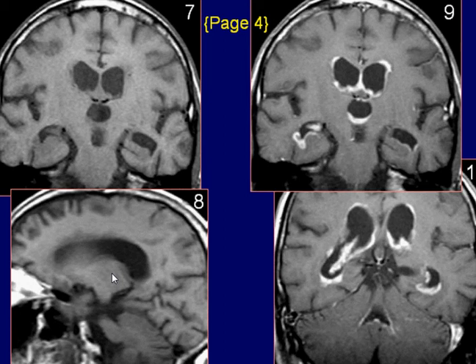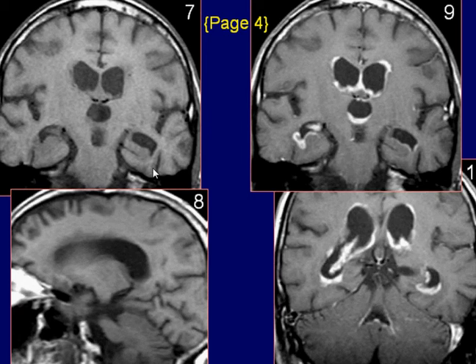T1-weighted images reveal dilated lateral and third ventricles. There are subtle periventricular hypo-intense areas.